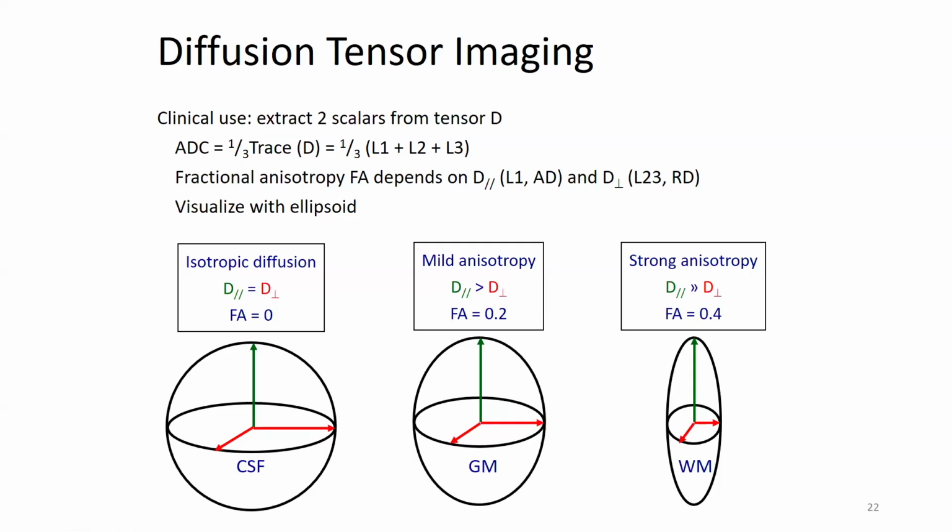If the red one becomes bigger, you could actually have what we call a pumpkin. So we do have two red ones and a small green one. You can have what we call crossing fibers, and I'll come back to that in a minute. No, it's not negative. It will be smaller because it can only be between 0 and 1. But the idea is say 0 for the CSF, and the more cigar-shaped it is, the more spaghetti-like. So this is water, this is macaroni, and this is spaghetti.